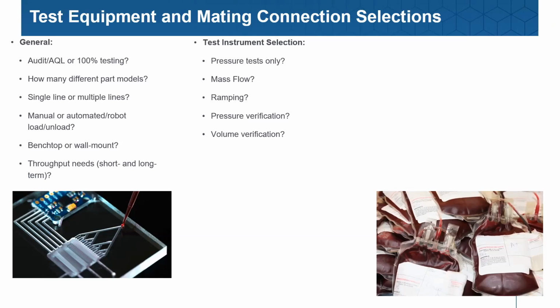And if not, we will see after that volumetric dump or delivery, we will see a higher than expected pressure, indicating, wait a minute, pressure did not make it all the way through the part. We're not pressurizing the full part, we're only pressurizing part of it. So we can reject based upon detecting that if we're trying to make sure that the entire interior is exposed to the pressure that we're subjecting.